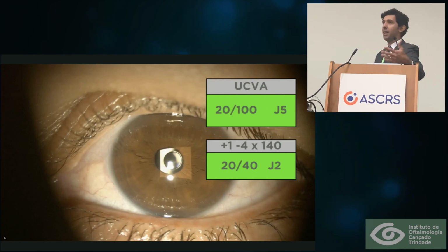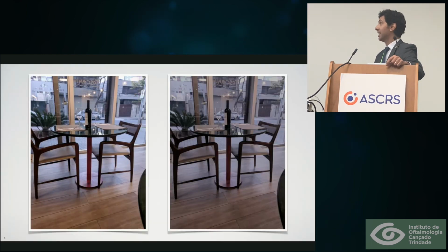We're talking about severe cases where glasses are on the table. I mean, they don't mind using glasses, but still we want to try the best. And this patient did very well at night. And she did report some changes under low light. She gave many details about this, and she sent me those pictures.